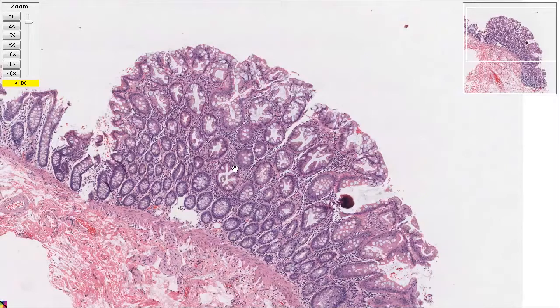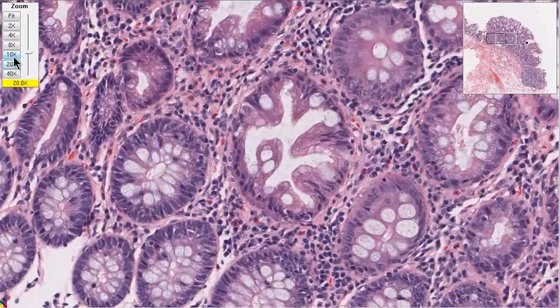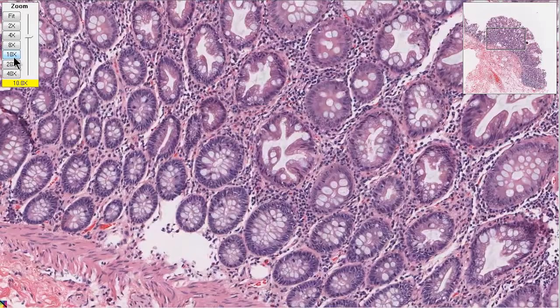So when you're looking here, the pathologist would look at this area and say, well, it's a dividing gland that's kind of thrown up in these areas. But largely, they're still making mucin, or they're this type here, which looks like it's tall and probably absorbing water. So even within these test tubes, there are also the absorptive cells as well.